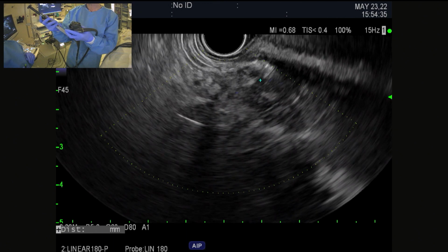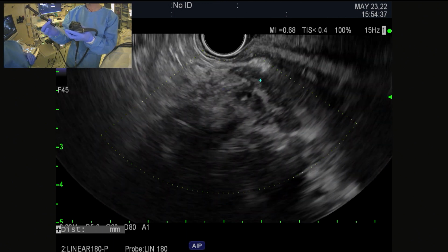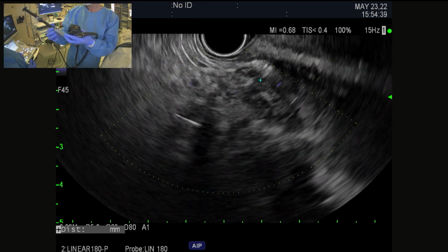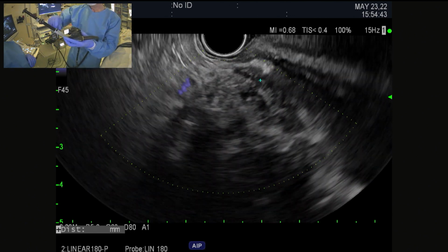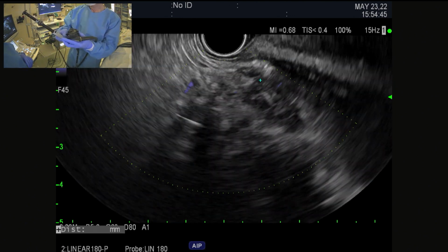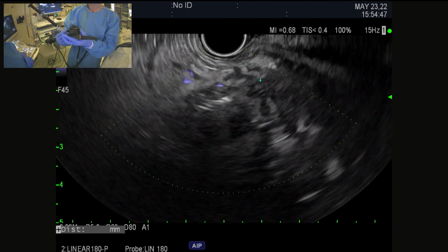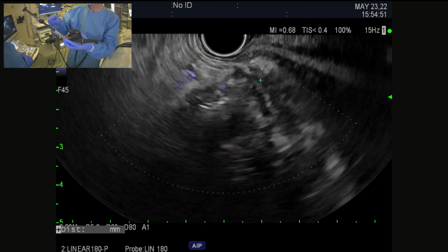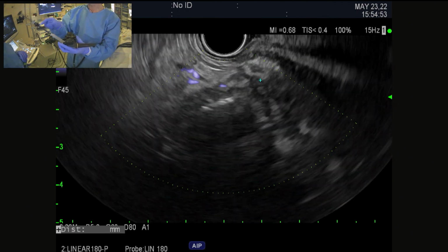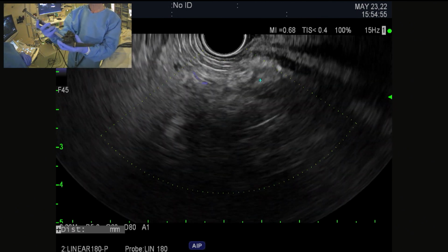So this is just working like an FNA needle. I'm going to advance the sheath out. So we have to unlock to do that. So I'm now pressing on. This is a swivel luer lock, by the way, so I can swivel it into orientation so that I can always see this. And there are even numbers here. So number 1 is on the black hub to push out.